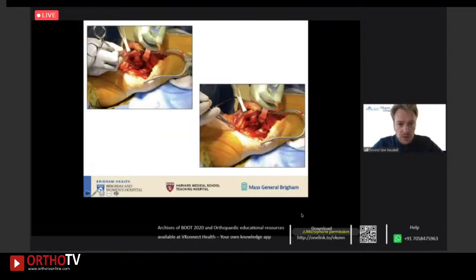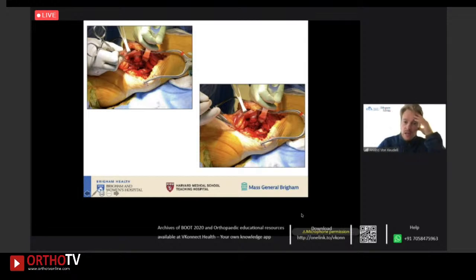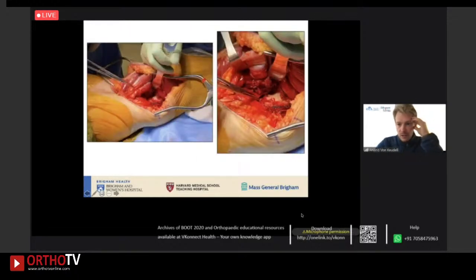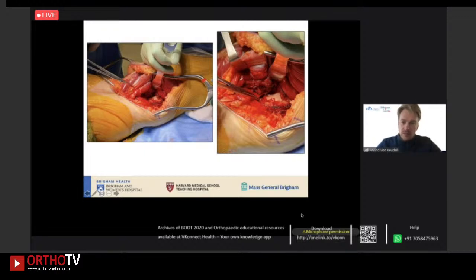Clinical pictures with the patient in the prone position. Retractor placement is incredibly important — use a Norfolk retractor and a blunt Hohmann to go to the lateral side for adequate visualization. If visualization is insufficient, dissect more proximally and release some of the medial head of the gastroc, incising along the crease to the lateral side and sometimes further up to gain more access poster-laterally.